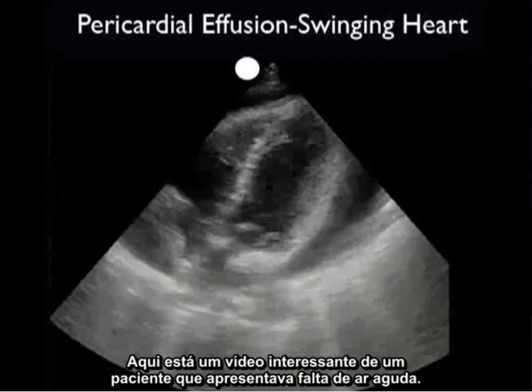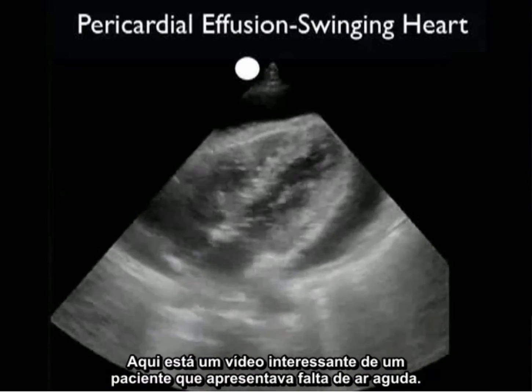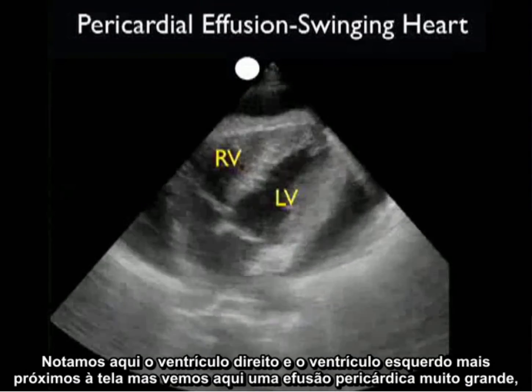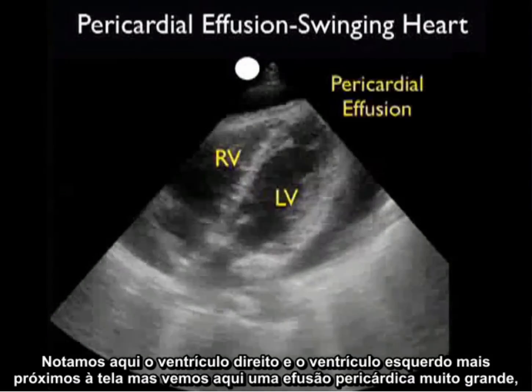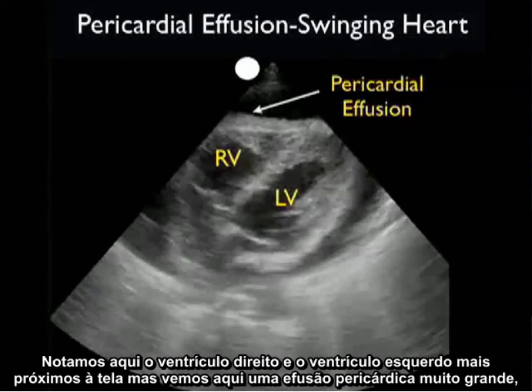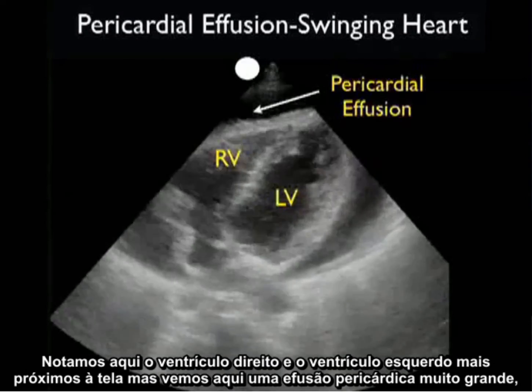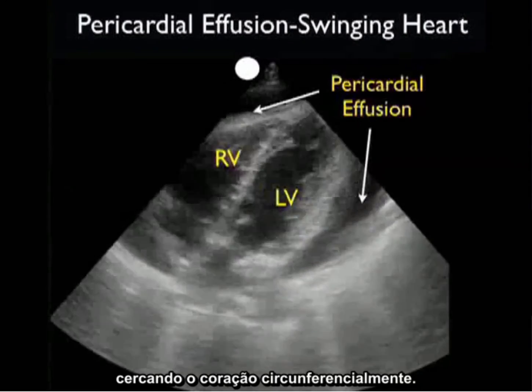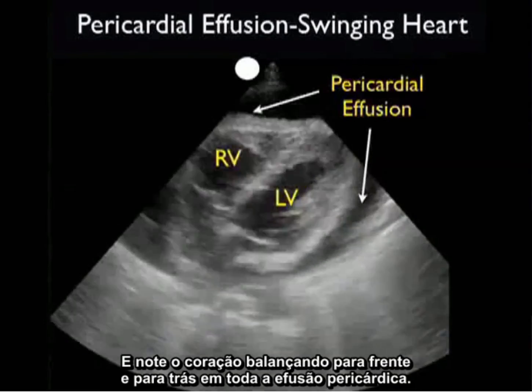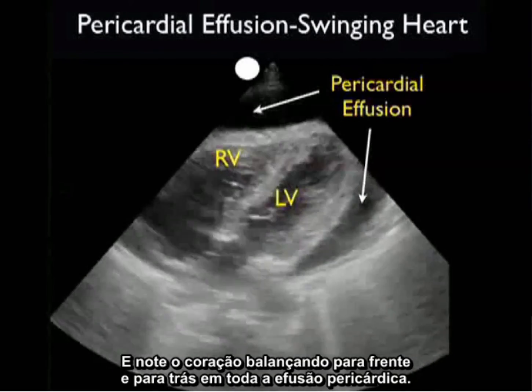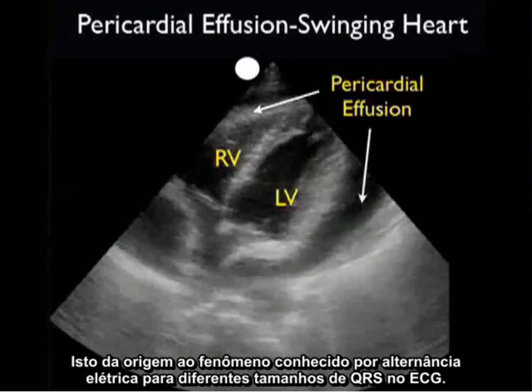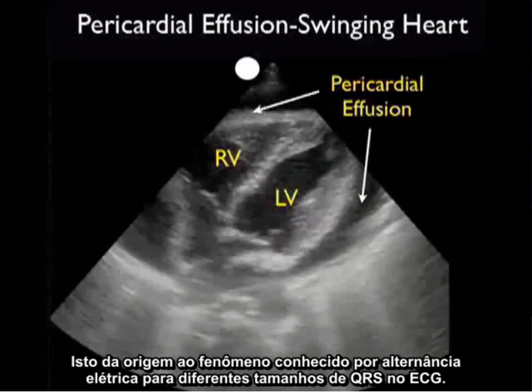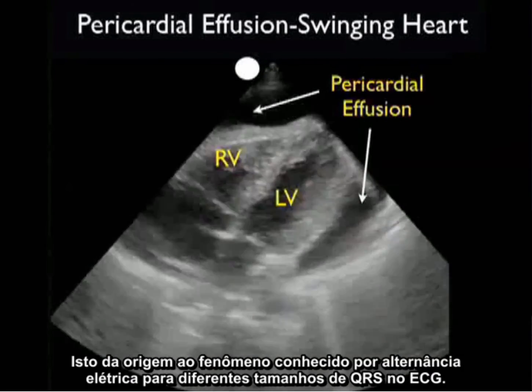Here's an interesting video clip of a patient who presented with acute shortness of breath. What we notice here is the right ventricle and the left ventricle closest to the screen, but we see a very large pericardial effusion circumferentially surrounding the heart. Notice the heart swinging back and forth in all the pericardial effusion. This gives rise to the phenomenon known as electrical alternans, or different sized QRS complexes on the EKG.